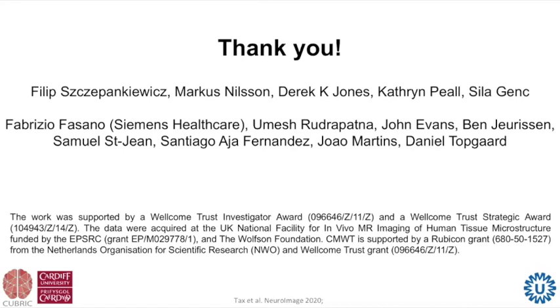Rician distribution is a special case of a single channel. You have a multi-channel coil. It's not a Rician distribution. Yeah, definitely. That's a good point. I think if we would go back to the raw data and try to reconstruct this in a more careful way, you could do all these corrections better.